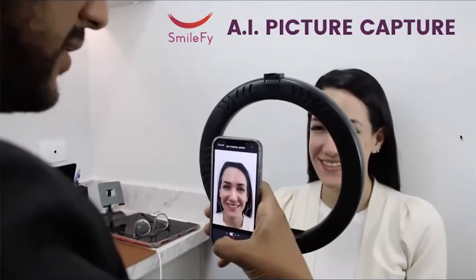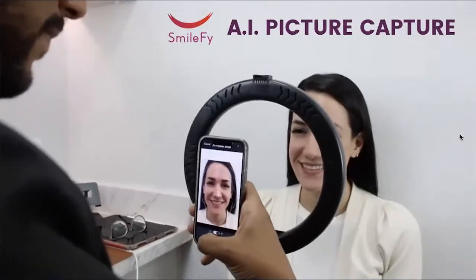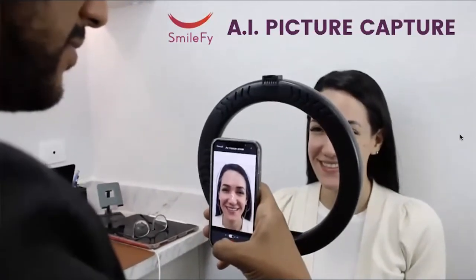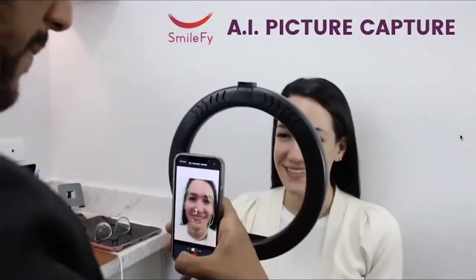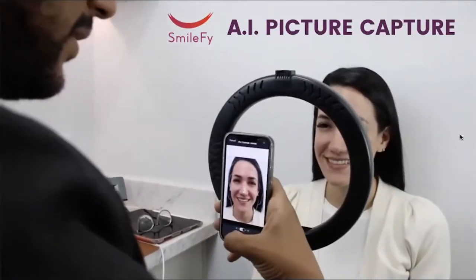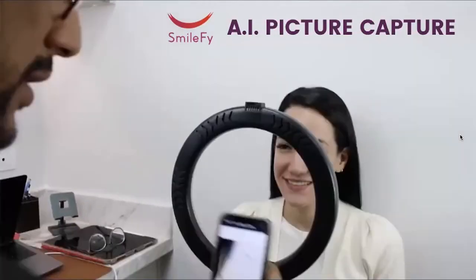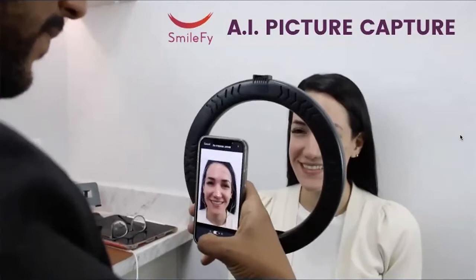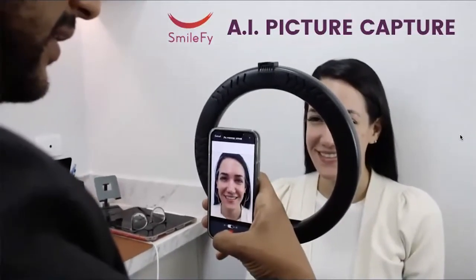Knowing that, I was able to communicate with her with visual communication, showing her different options, showing her how she could see herself with a type of treatment that goes much farther than what she came in for. So I'm going to share my screen.